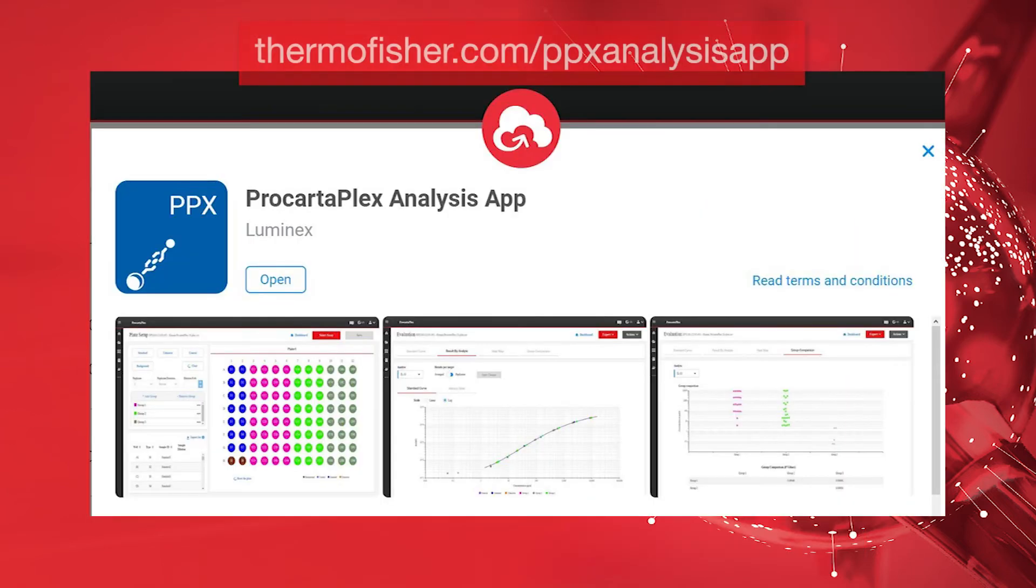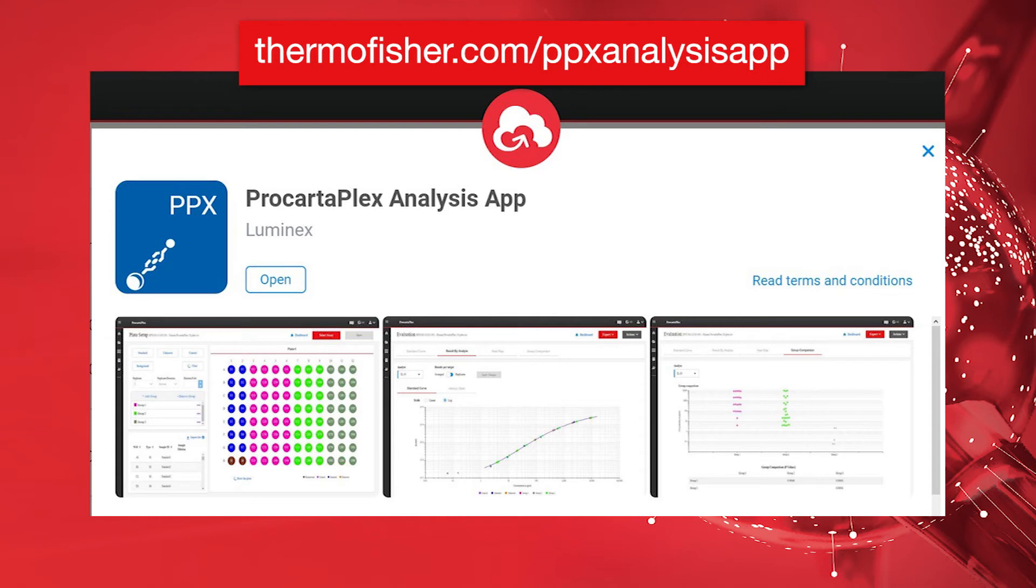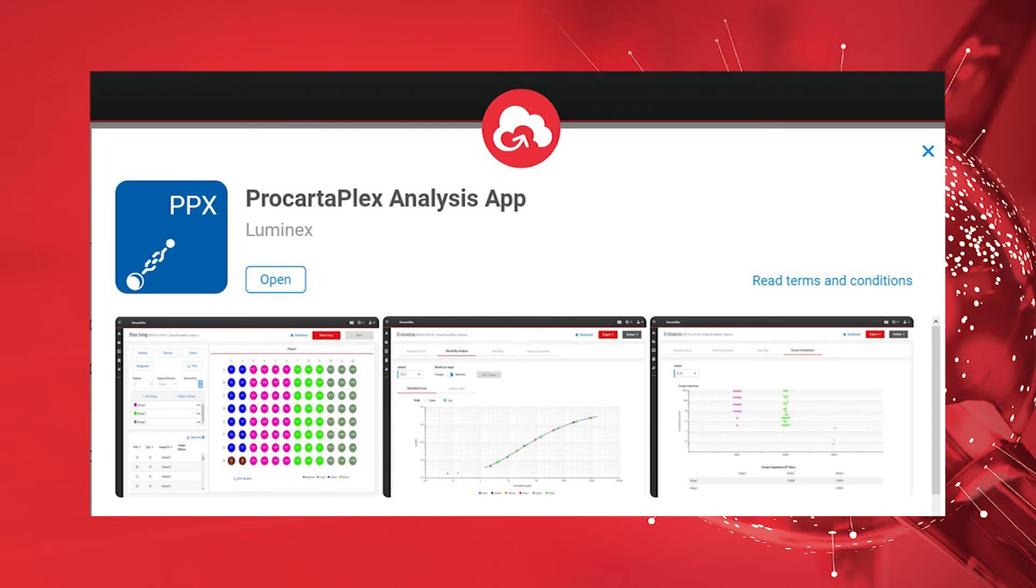Please visit the ProCartoPlex Analysis app at the URL shown to learn more about how to easily set up these details without manual data entry.